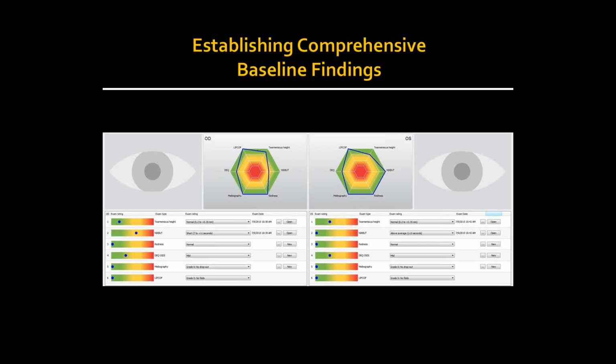So if this patient, for example, say you applied some sort of artificial tear treatment, some sort of steroid treatment, let's say you go to a medicated drop like Restasis, some sort of application for the patient, then the patient comes back at X number of days or weeks after for a follow-up, and you want to monitor their progression, you can go ahead and repeat the same tests, and you can see how their patterns changed. You provide them with that treatment, they see that there's improvement, they can understand that, okay, my efforts mean something.